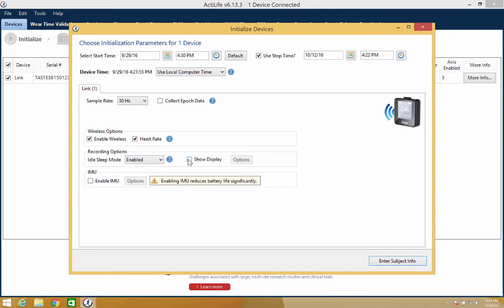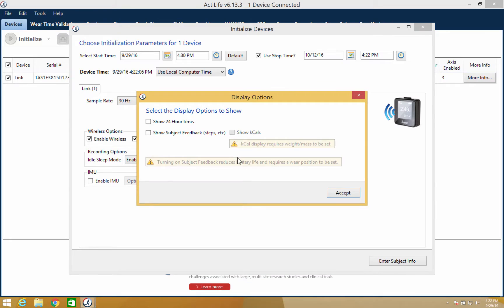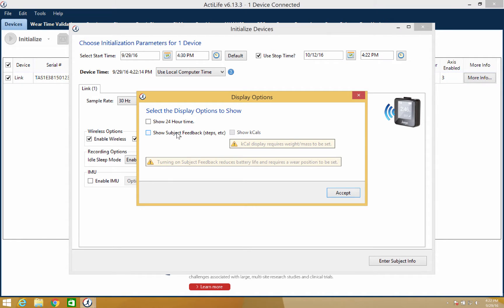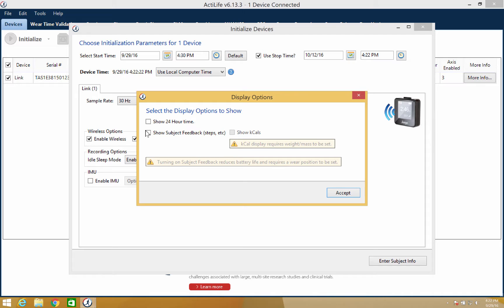The GT9X link contains a display screen, which you can choose to turn on or off. If you select on, then you can activate additional features by selecting options. These additional features are 24 hour time, subject feedback which includes steps, and show KCALs. Once you have selected your options, select accept.